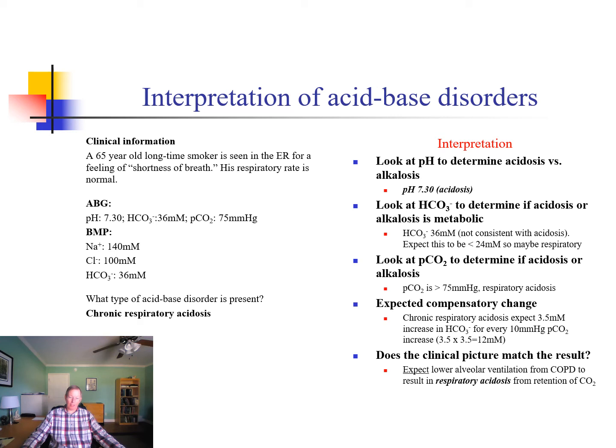So I'm going to go to the CO2. CO2 is greater than 40. That's consistent with a respiratory acidosis. Now I have to look at my compensatory change to see whether it's acute or chronic.